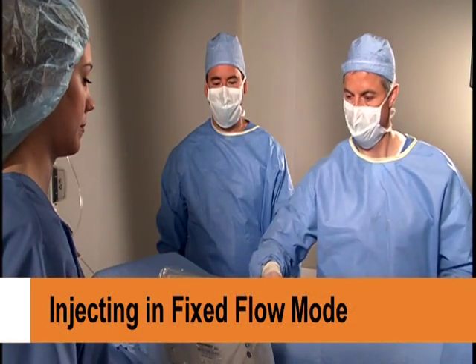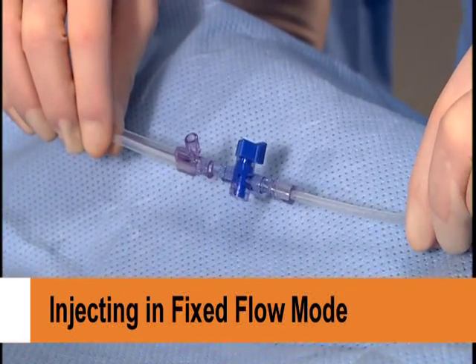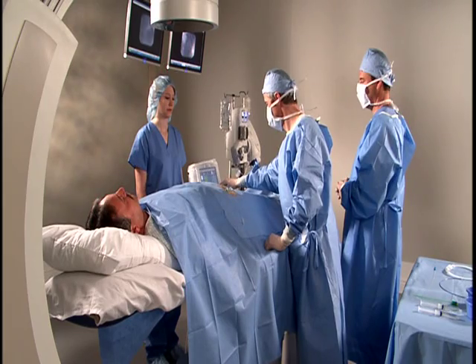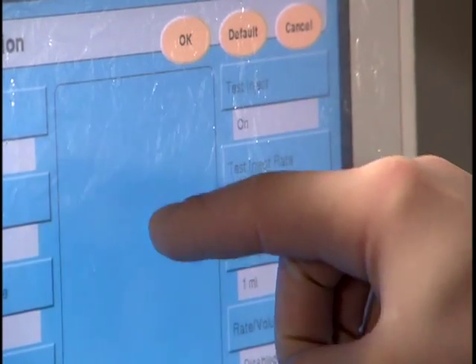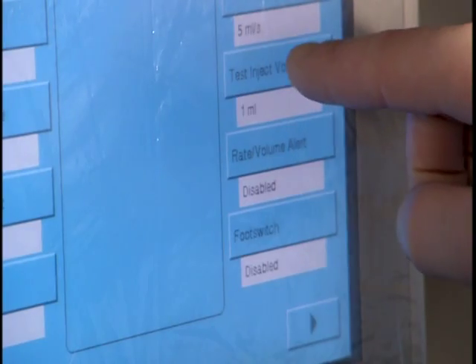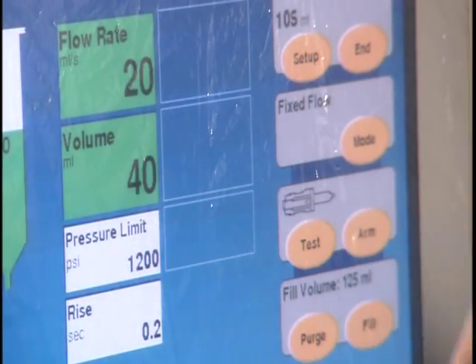When arming the injector in fixed flow mode, verify that air is purged from disposables and the injection parameters are correct. Performing a test injection is optional. A test injection delivers a limited amount of contrast, referred to as a puff, at a set flow rate and volume to verify catheter placement. Test injections are delivered at fixed flow only and programmed from the configuration screen.